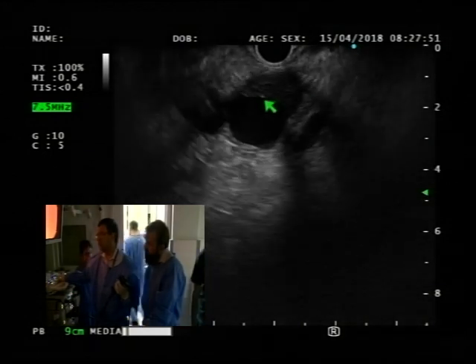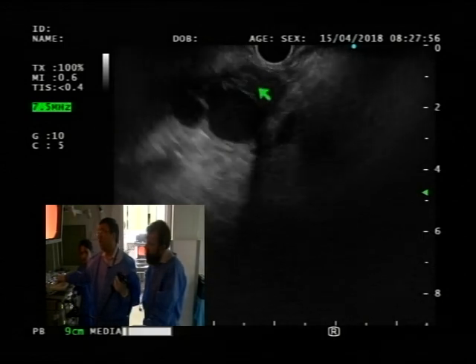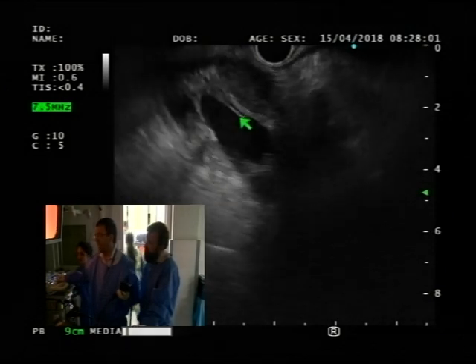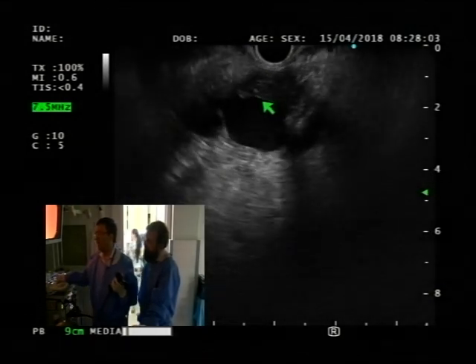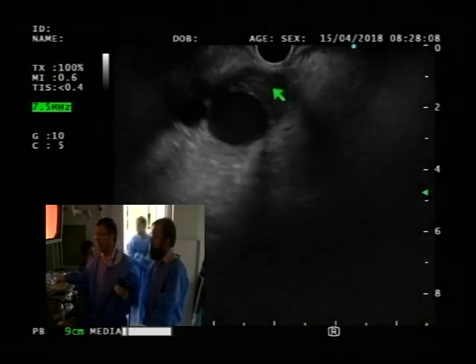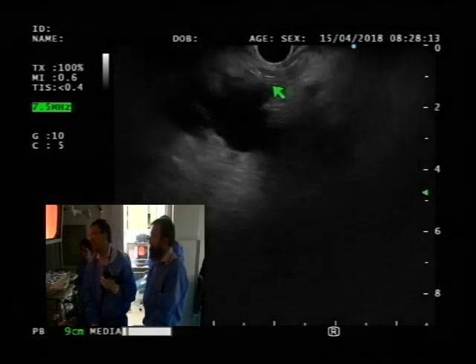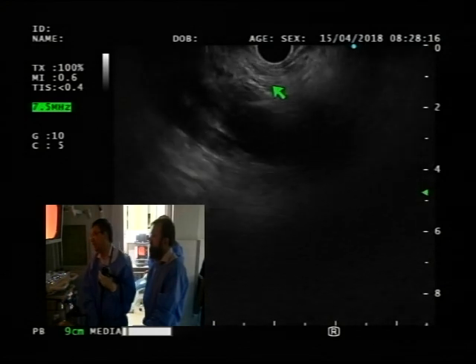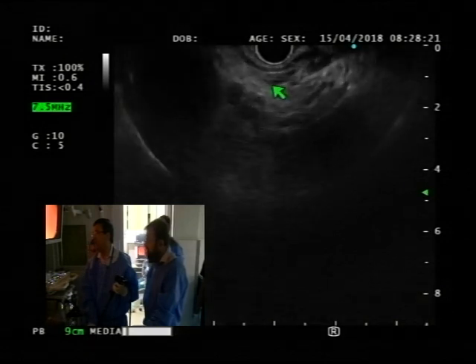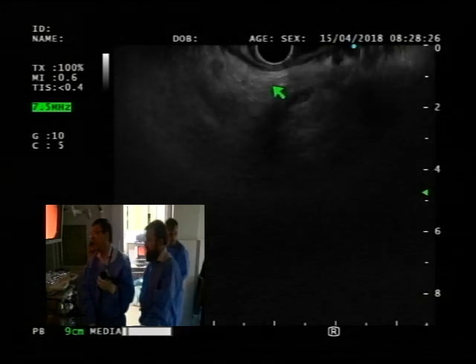I think we can get the CT read again and then stick this area. Sometimes a tumor clot or a tumor itself can look like a clot too, but to me this one is more likely a clot itself, as I don't see the rest of the pancreas. If there was really a mass, I would see at least a ductal dilation distal to that. The only thing I see is the collaterals there. Yes, there are a lot of collaterals there, so that also definitely supports that it's a clot.